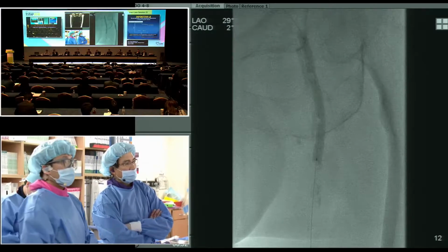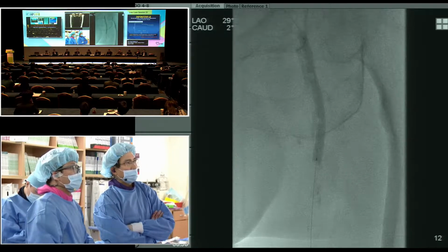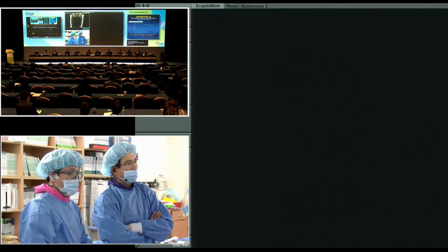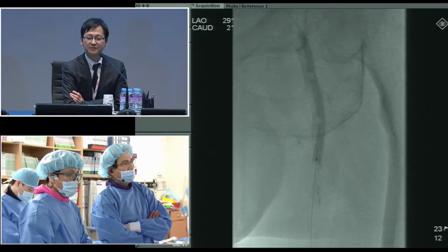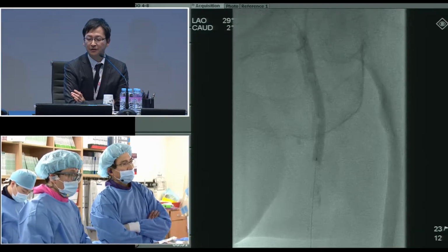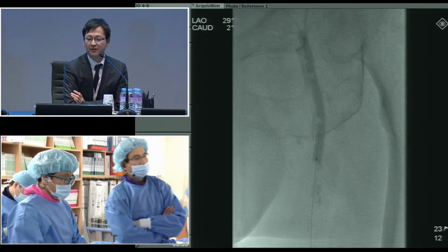Dr. Ida, if you implant a stent in the common femoral artery, what kind of stent do you use in Japan? I prefer the Life Stent or Innova stent, more flexible stents. But I just discussed with Dr. Gufik, the presenter of the TECO trial.